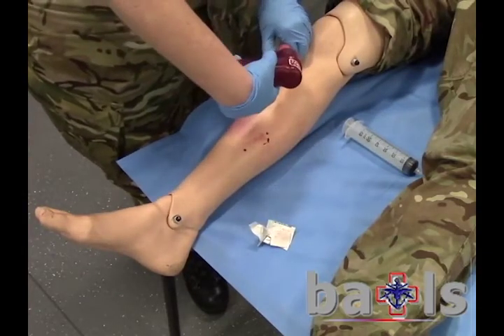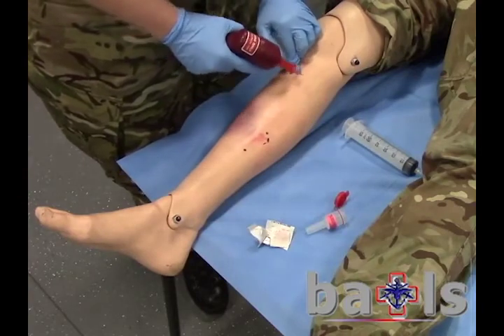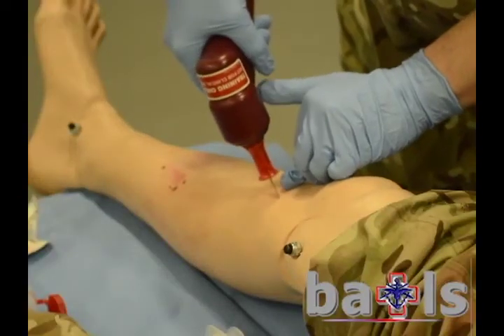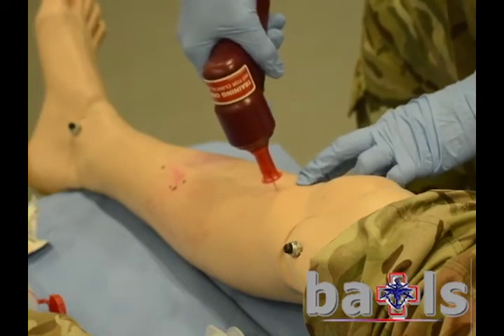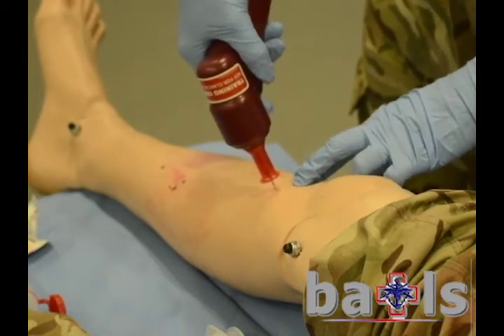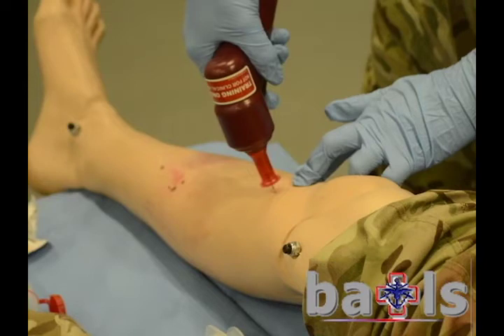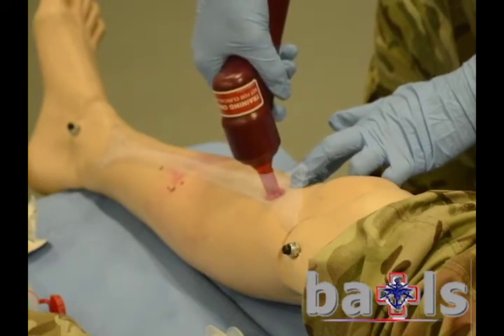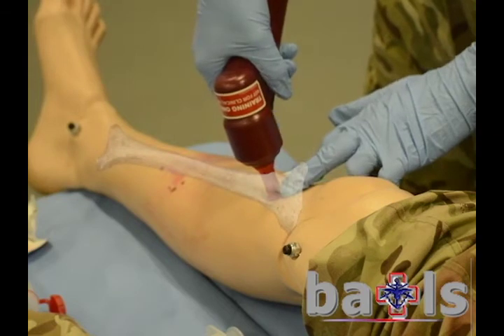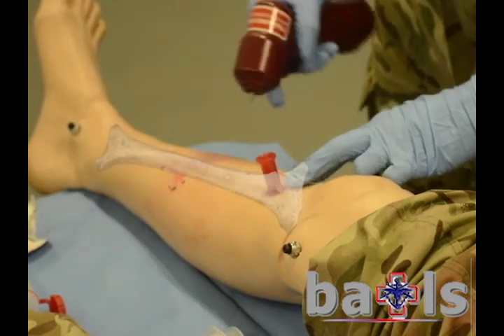Control the patient's movements during insertion. Using an appropriately sized needle attached to the drill, push through the skin at the site until the needle contacts bone. Ensure that one black line is visible on the needle above the surface of the skin and that the needle is at 90 degrees to the surface of the bone. Apply steady downward pressure while squeezing the trigger on the drill. A sudden give or pop is felt upon entry into the medullary space.